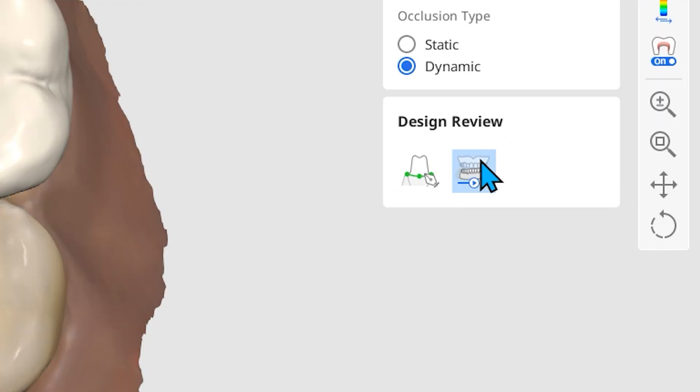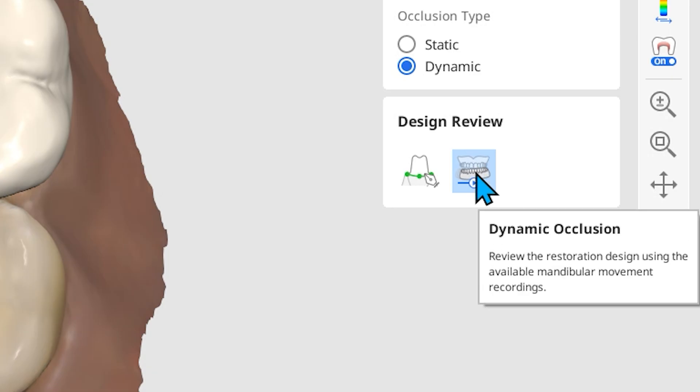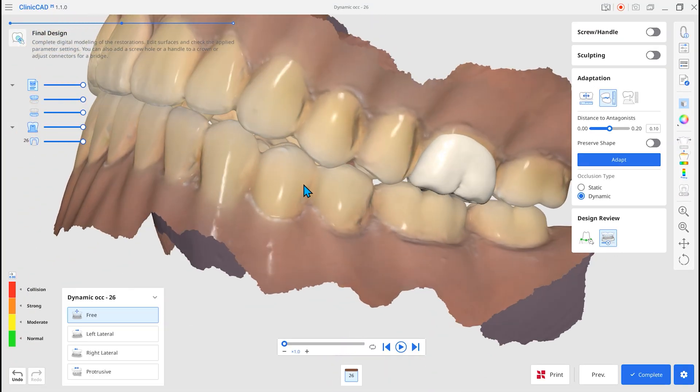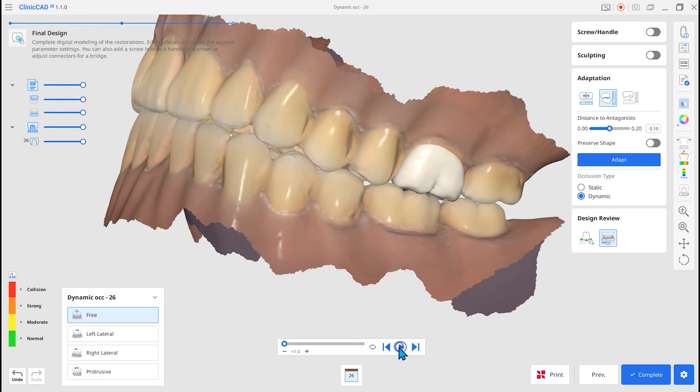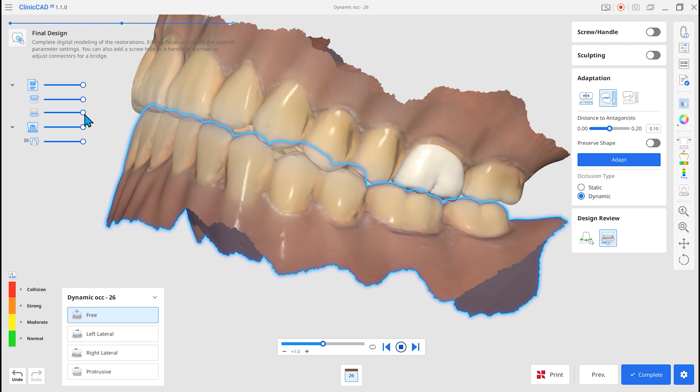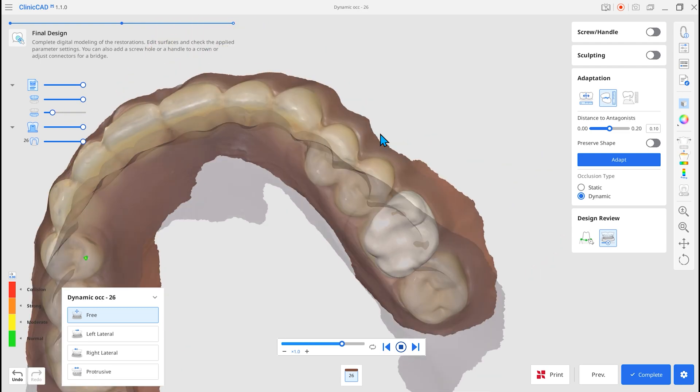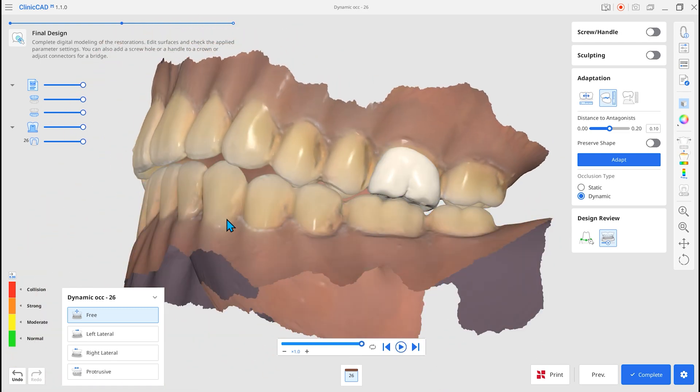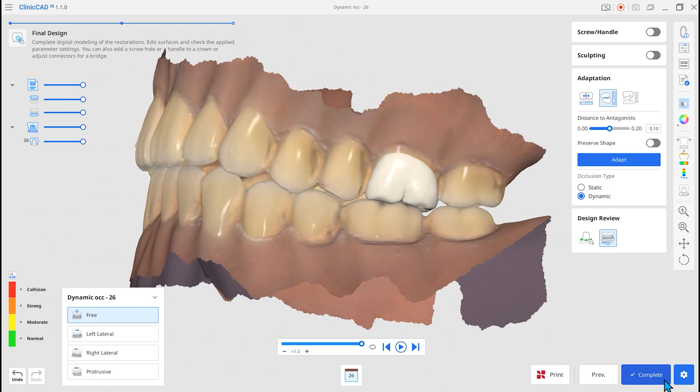Click the Dynamic Occlusion in Design Review to simulate mandibular movement. With Dynamic Occlusion, you can design restorations by incorporating mandibular movement.